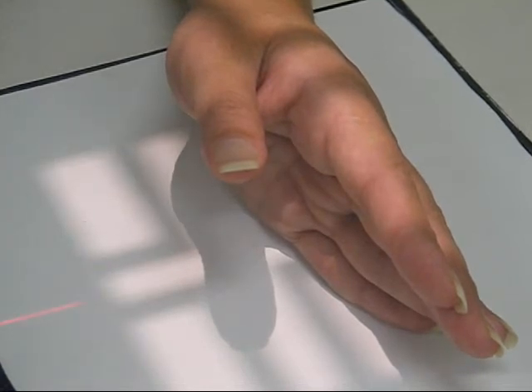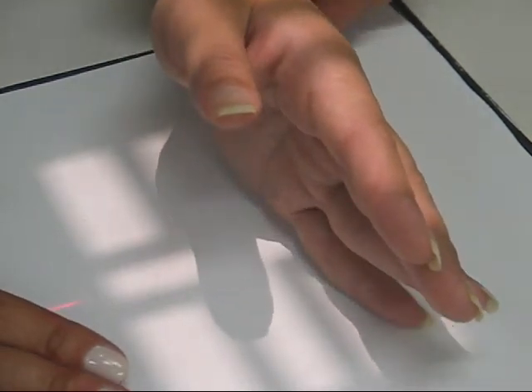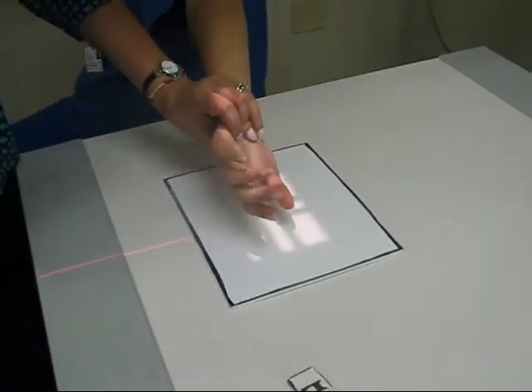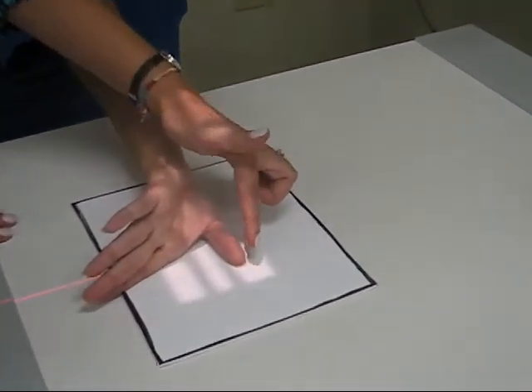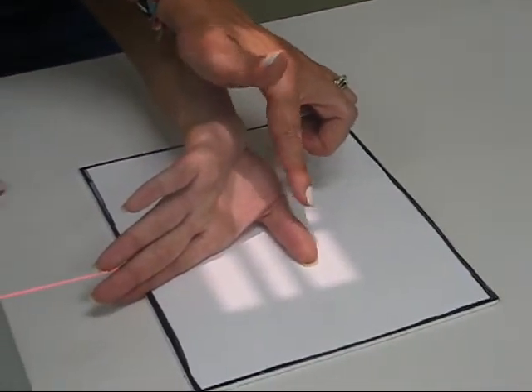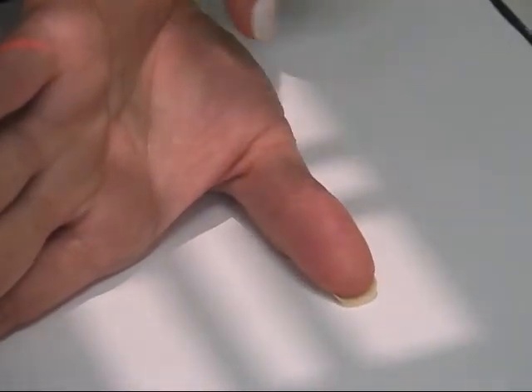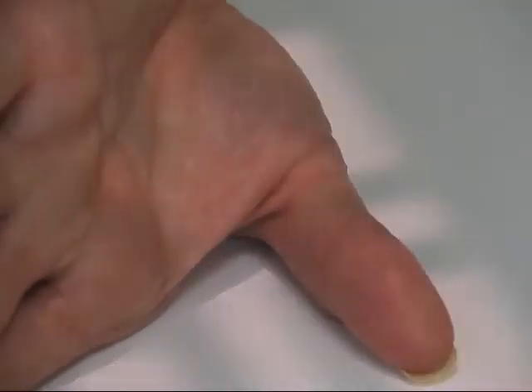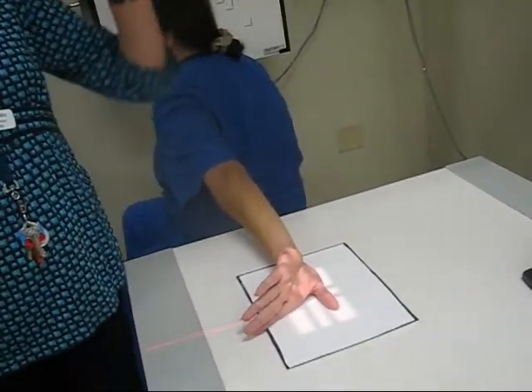If you don't want that, and you want something with the most detail possible, you're going to have your patient turn their hand around and place the other fingers out of the way. So in this case, you're having an AP of the thumb instead of a PA of the thumb, but it's still going to give you a good visualization of the spaces in between the joints and everything that you need.